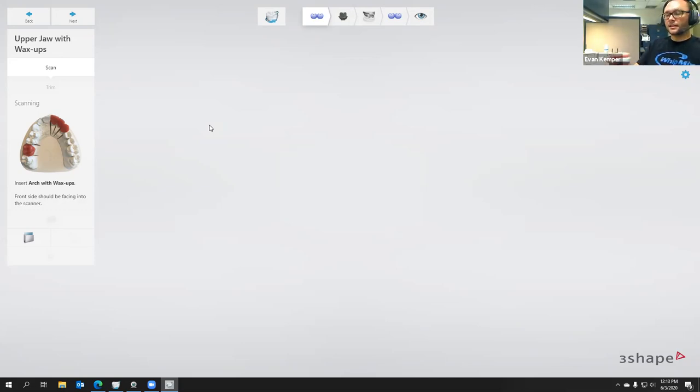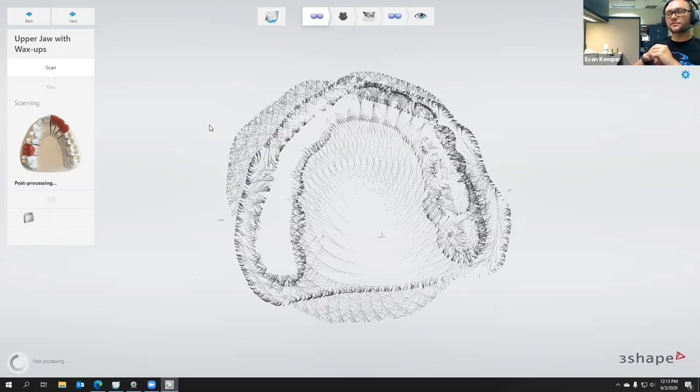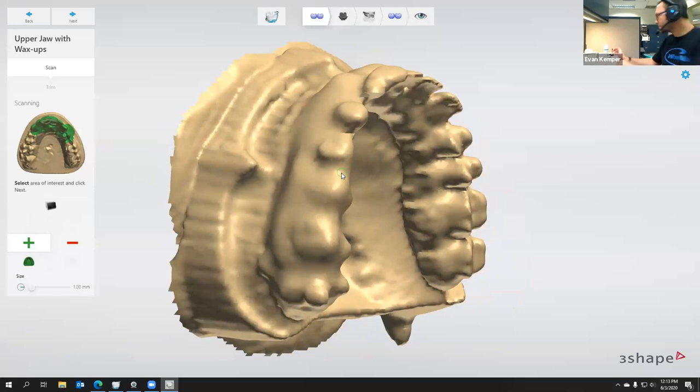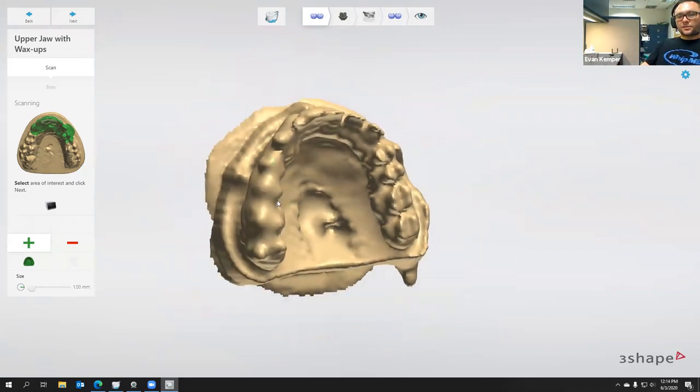So then we'll go ahead and put it on a plate, and just like anything else, put it in the scanner. Now, we'll see, I may have to spray the zirconia side of this because it is glazed and polished, so it may be a little too reflective to get a good scan. And actually, I'm just gonna go ahead and spray it now before we do the actual detailed scan. So just added a little scan spray to kind of mat that surface. And we're just going to do the whole arch.